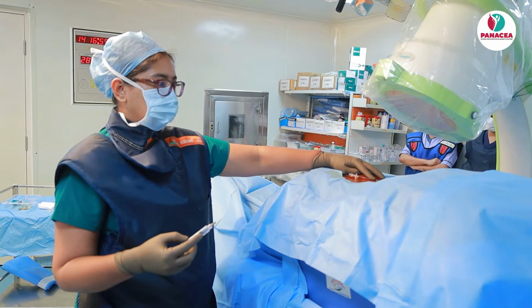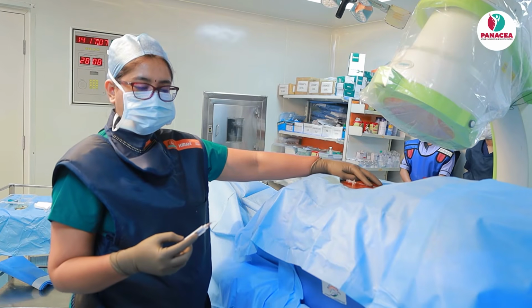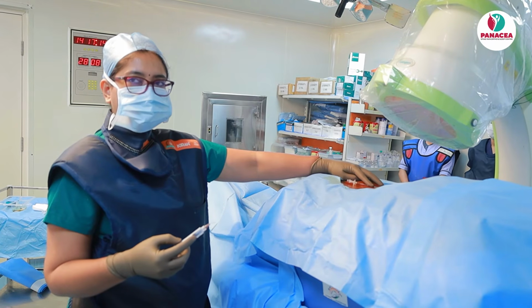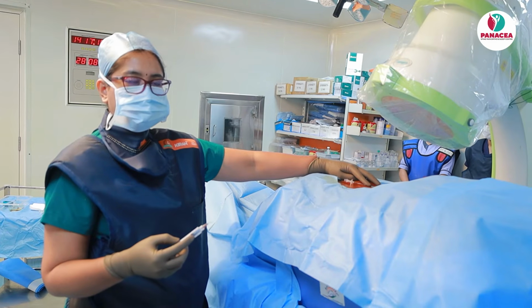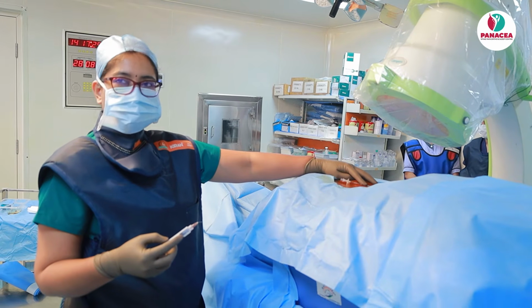So after attaining an oblique fluoroscopic image, the Scottish dog appearance, local anesthesia is being infiltrated with 1% xylocard. Xylocard is normally available in 2%, but it is made 1% by adding normal saline. It is methyl paraben free, which is a preservative which can be allergenic to some of the patients. So we are using purely preservative free.